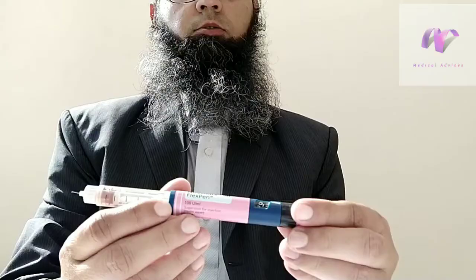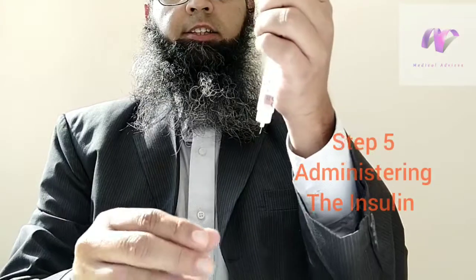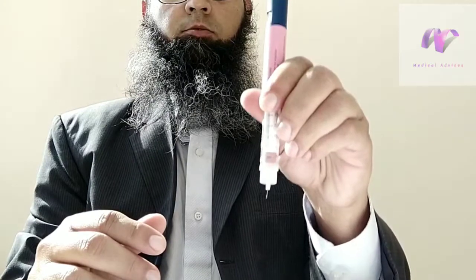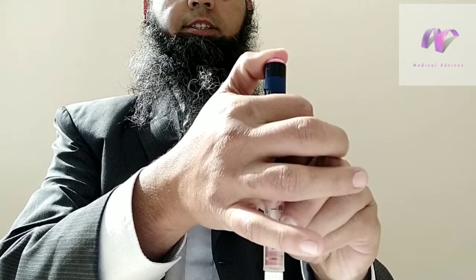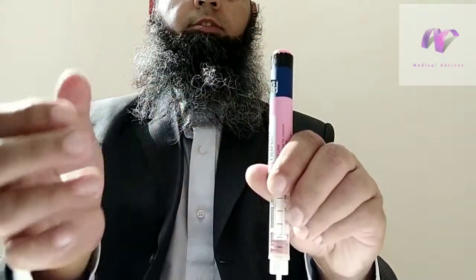So once you're clear that you're going to administer the insulin in the required place, you will load the required insulin unit. You can hold it like this, so that you can insert it in a perpendicular way, and you can administer the required insulin unit by pressing this. Or you can hold it like this, and insert it in a perpendicular way to the injection site, or you can use another hand to administer the required insulin dose. So once you're done, you press it, hold it for 1-2 seconds, so that all the insulin administration is done. After you've done it, you first need to remove the needle, and the insulin dose is administered now.